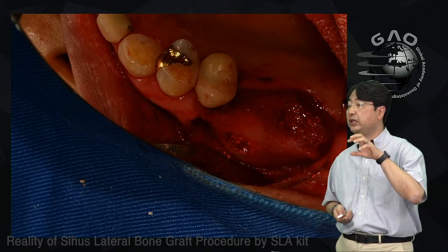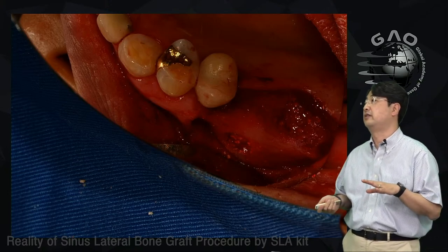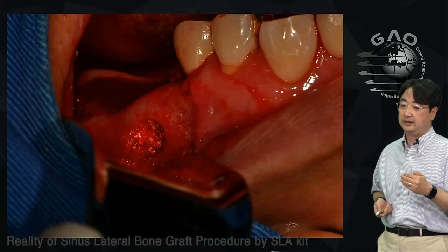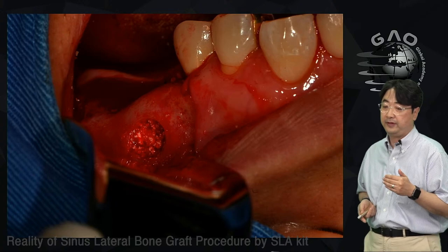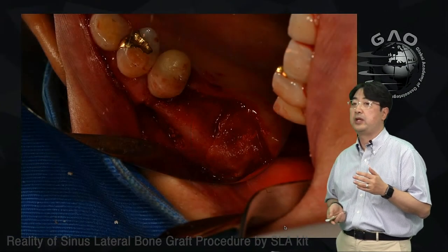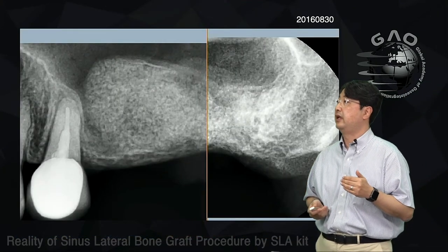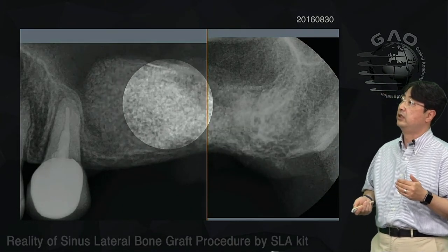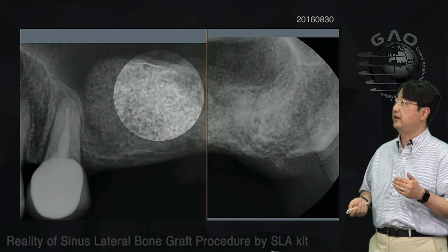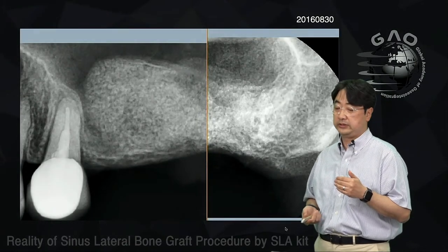I made a lateral window to dissect the tearing membrane, right? And I did the bone graft on the crestal area from the crestal opening. Okay, so here you can see the bone fill, right? And I covered the crestal opening with the PRF membrane, and I closed the suture like this. And this is the periapical radiograph of this patient after the bone graft. I did the lateral approach here, and I did the crestal approach here, right? So here is where the opening was.